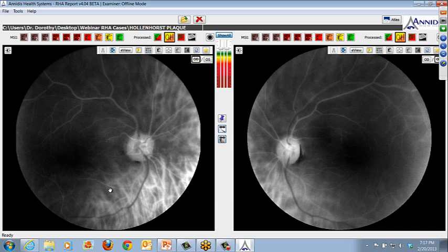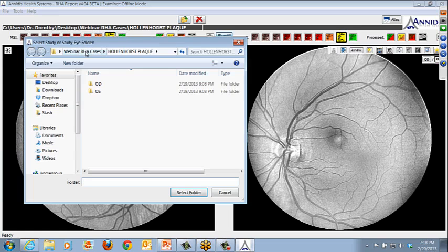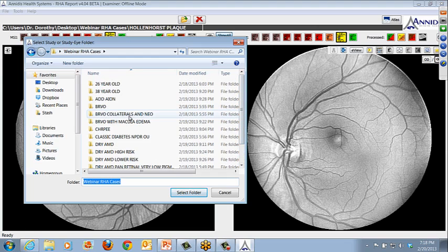If this were a fibrin or calcific plaque, which of course localizes to a slightly different area in the cardiovascular system typically, then you would see potentially some occlusion. So if you're having that difficulty, that will also help you differentiate the plaque type, will change the cardiovascular workup to some degree, and assist your internist in focusing on the patient's appropriate therapy. So just wanted to show that briefly. That's not overly exciting. We see those lots, but just an example of how to differentiate and how different tissues are hyper-reflective with the different LEDs depending on location.